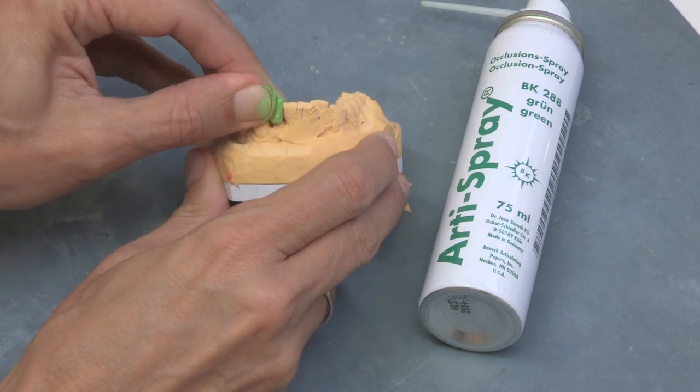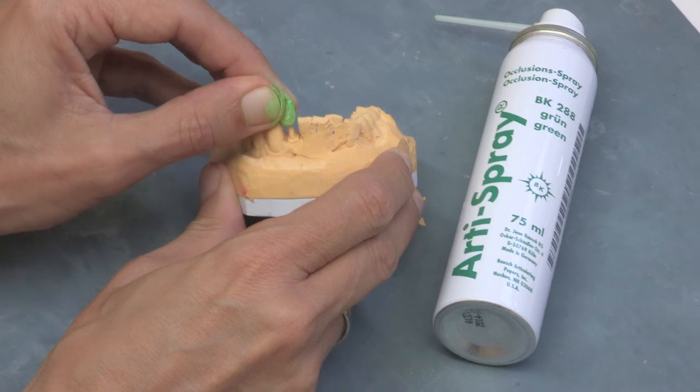Arti Spray can be used for approximal contacts when trial seating crowns and bridges.